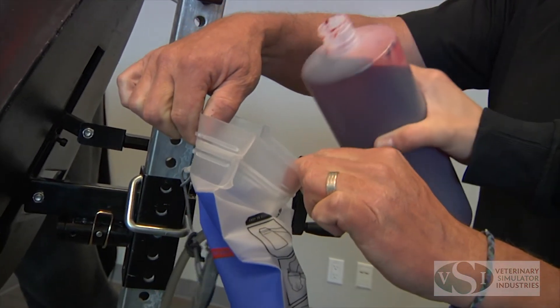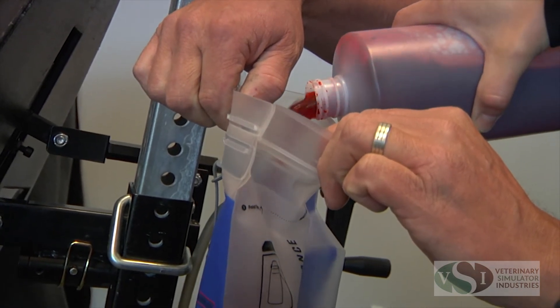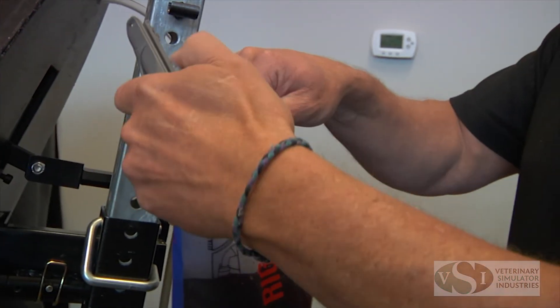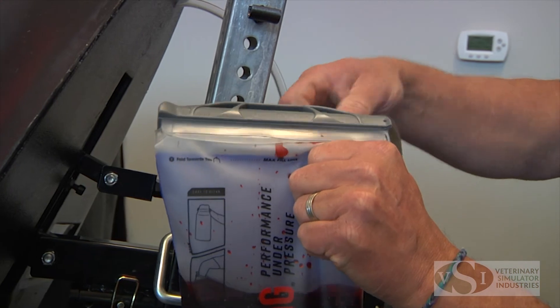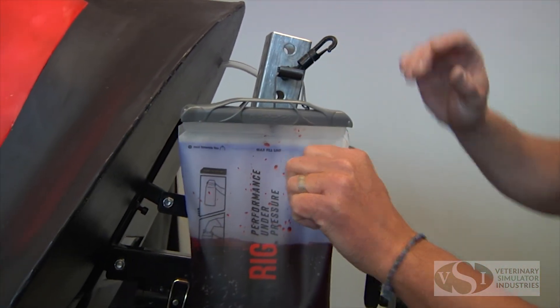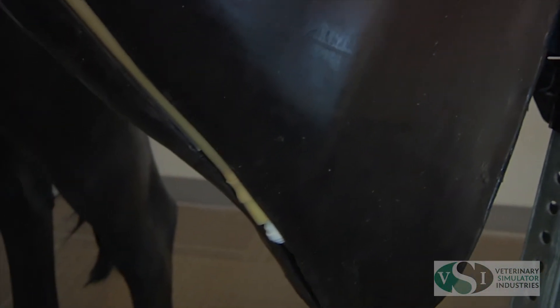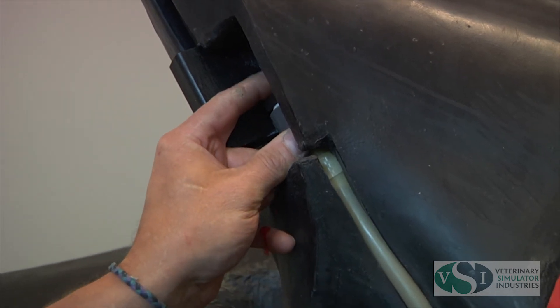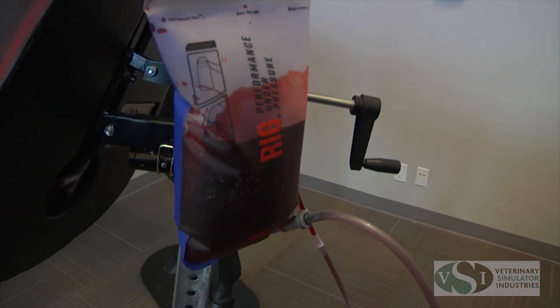Fill the fluid bag with the VSI venipuncture fluid that comes with the model. Pressurize the bag until the fluid fills the line and you can see the fluid in the vein tubing. Press the bleeder valve attached to the grey adapter to allow the air to release from the tubing. Do not hold the valve when the vein tubing is full, as this could result in fluid leaking out.